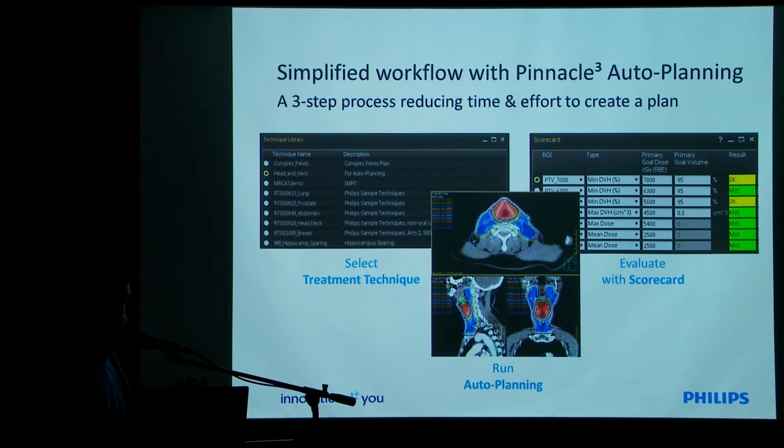Basically, the work is done in generating what's called a treatment technique. This gets loaded, and then auto planning is run, and you can evaluate the plan at the end. You can also continue to optimize the plan if you wish, or you can run it another time with different clinical settings. It's very simple to use.